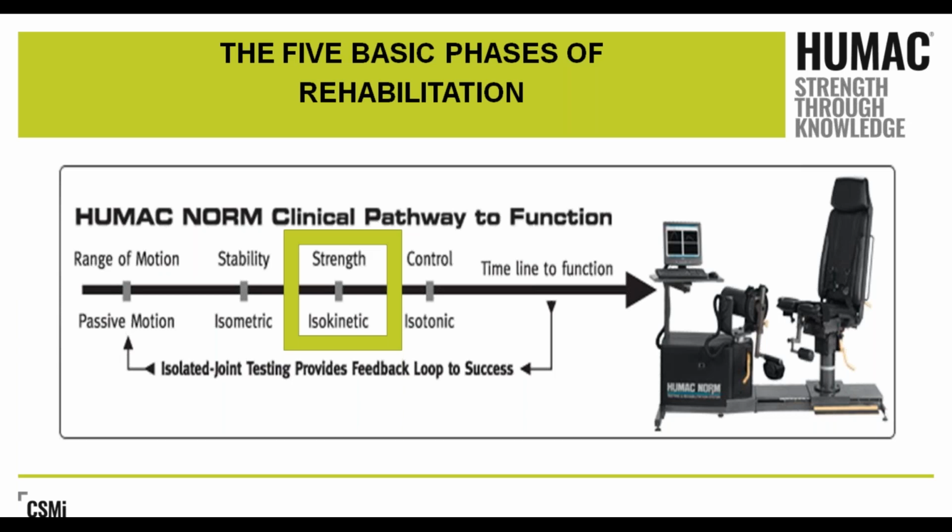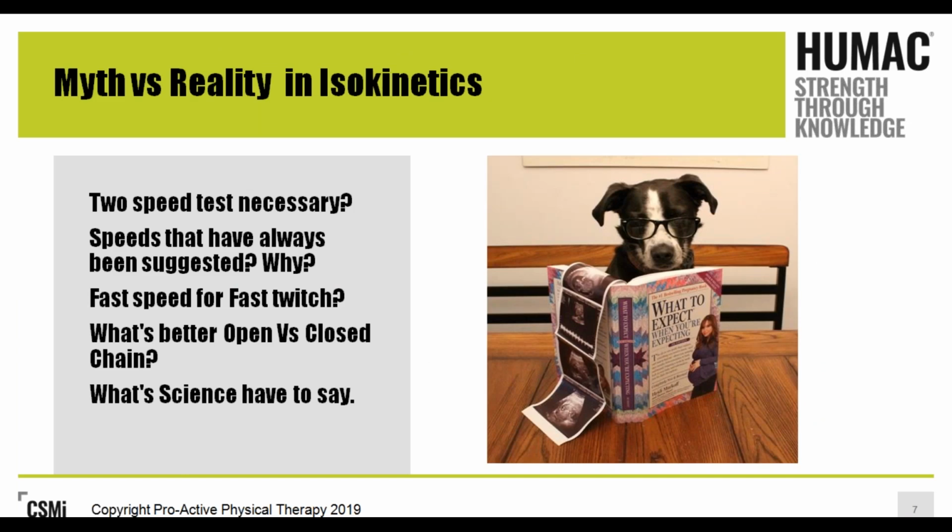So let's go back to some myths versus realities, because this keeps coming back up, and I hear this all the time. Do I need to do 2-speed tests? Are they necessary? I'm just going to come out and say that no, 2-speed tests are not necessary. If we look at the force velocity curve, which we'll take a look at in a little bit, we know what's going to happen when we do these tests. If you've done 2-speed tests in the past, that usually means you're doing concentric reciprocal. One thing you notice is that as the speeds increase, the torque curves decrease or get smaller. That's exactly what we would expect in the force velocity curve. So is it necessary for us to do 2-speed tests?